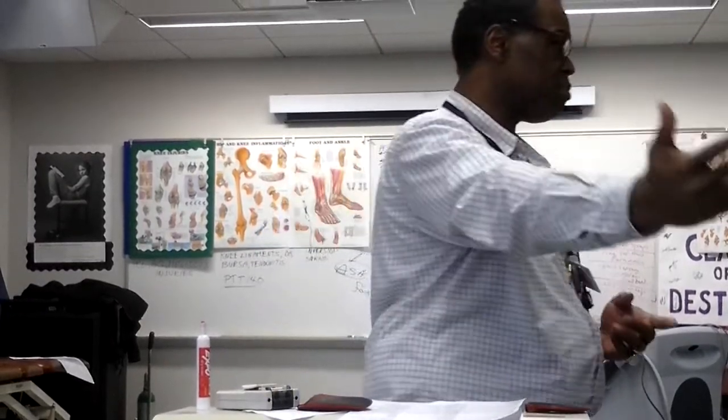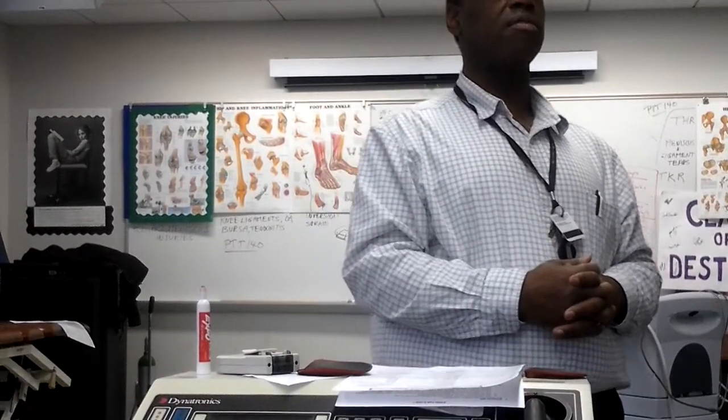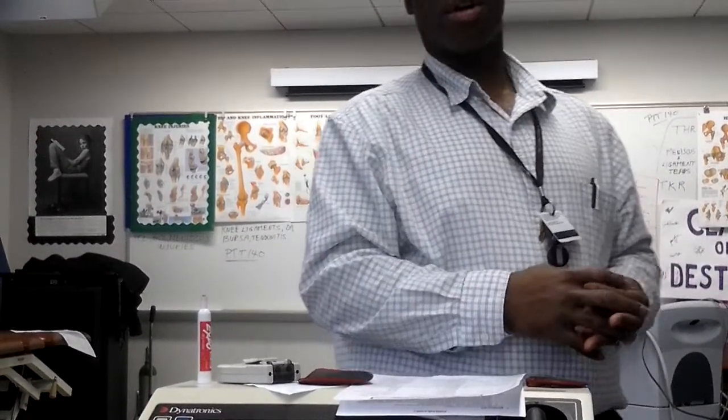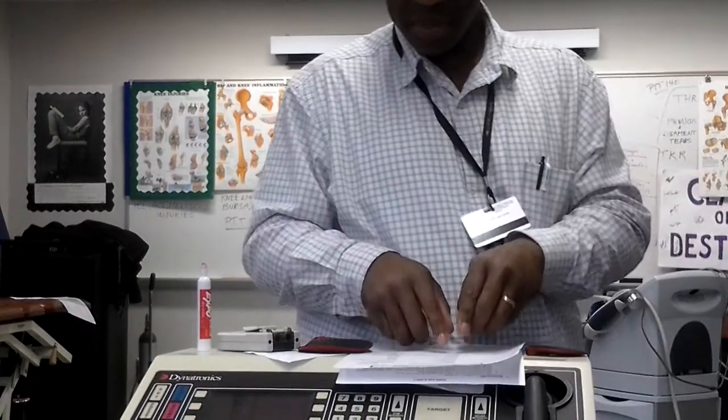What do we care about, though? What they feel, what the patient says. Can we get the movement? If we don't get the movement, and your leg is at 45 degrees of knee extension and we're trying to get 0, and they say, turn it down, you can't say, we're sorry, but we're trying to get knee extension, so get over it, stop whining, and just move on. You can't say that.